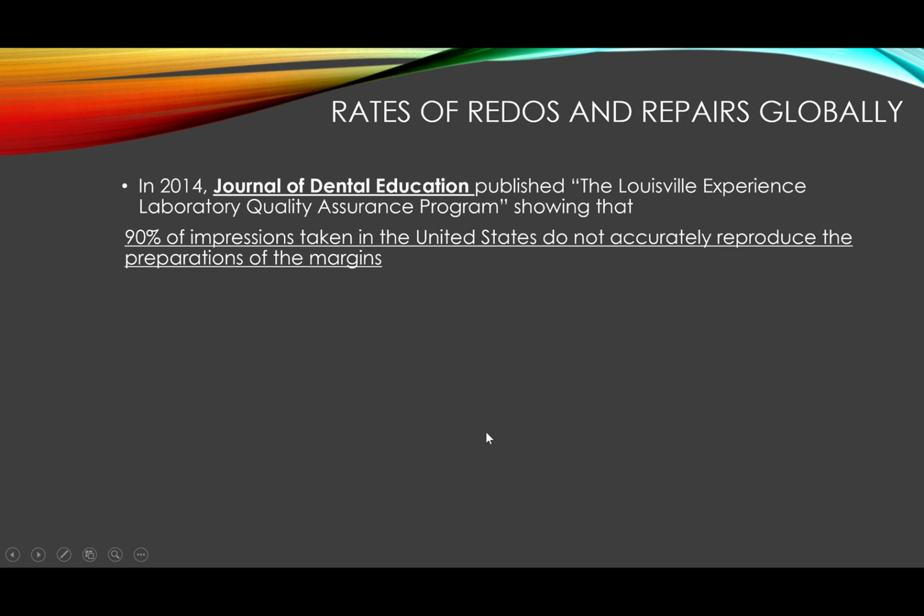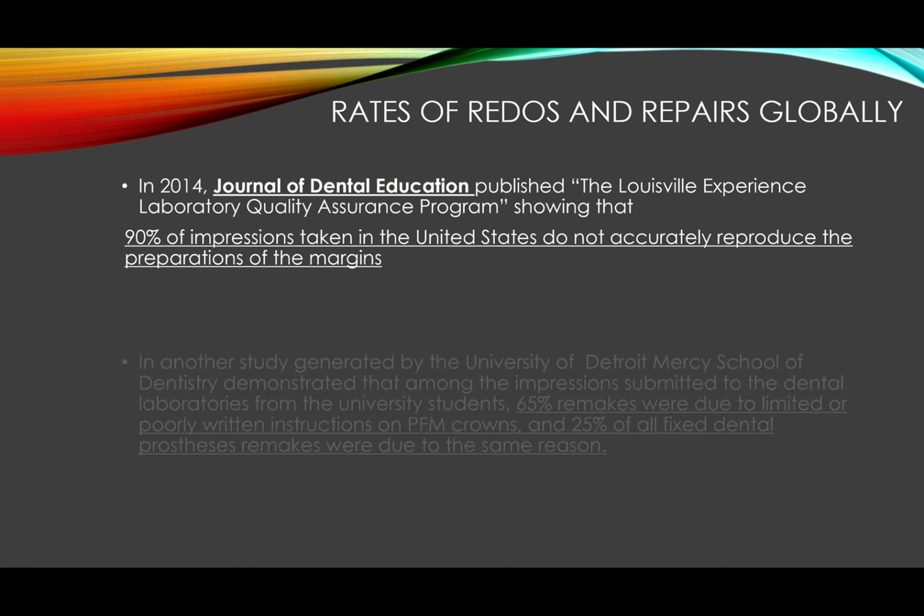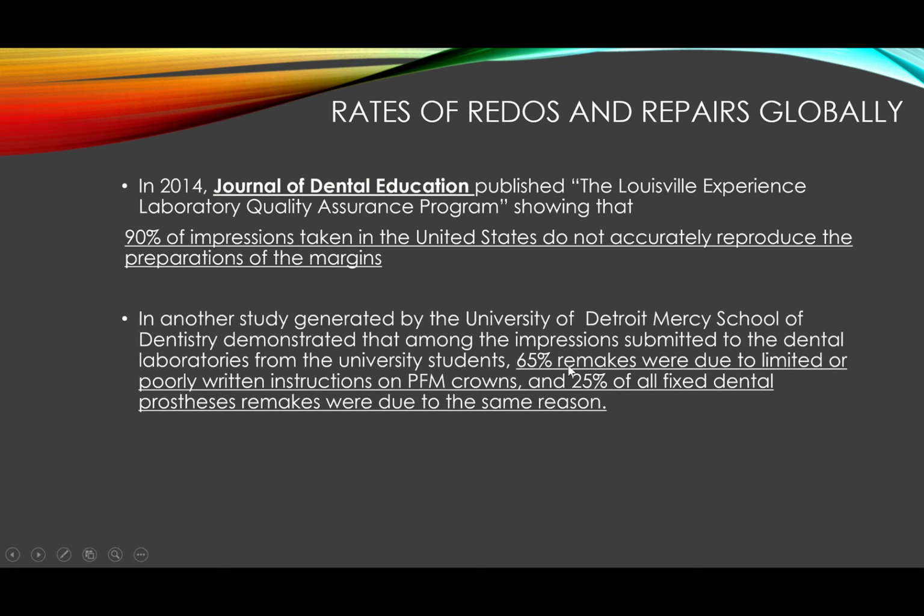Now, in 2014, the Journal of Dental Education published the Louisville Experience Laboratory Quality Assurance Program. This was something, man. When I first read the details about it, it was something. 90% of impressions taken in the United States do not accurately reproduce the preparation margins. 65% of remakes were due to limited or poorly written instructions on PFM crowns, and 25% of all fixed dental prosthesis remakes were due to the same reason, which is limited or poorly written instructions. All right? Communication.